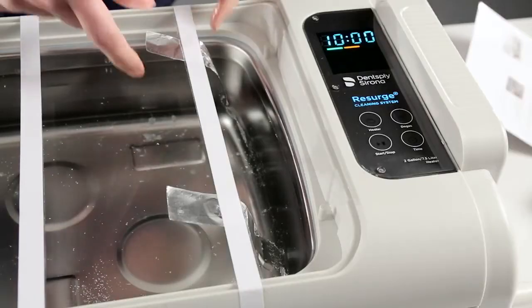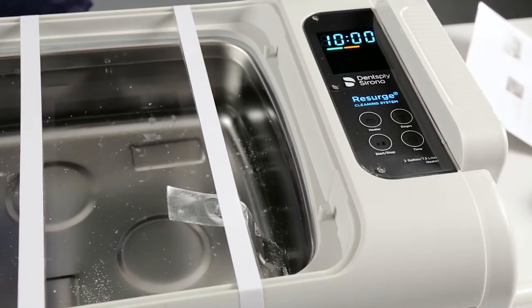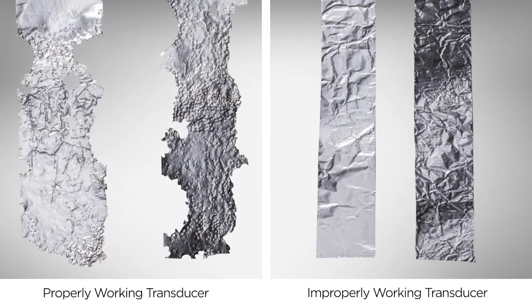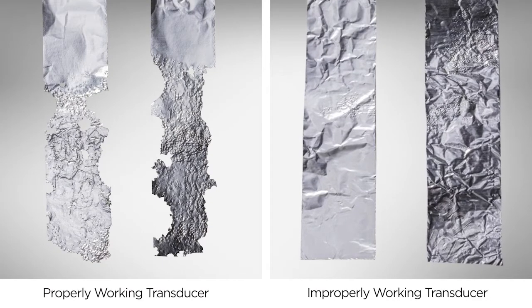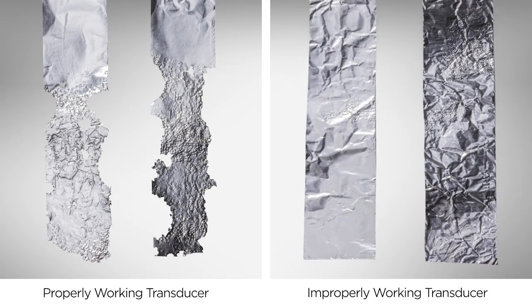The amount of holes in the foil is somewhat dependent on how close the foil strip is to the transducers in your bath. If the cleaner is functioning properly, the ultrasonic energy will penetrate the foil, leaving holes or tears. If there is not enough energy due to an improperly working transducer, there may be pitting or wrinkles in the foil but few or no holes.